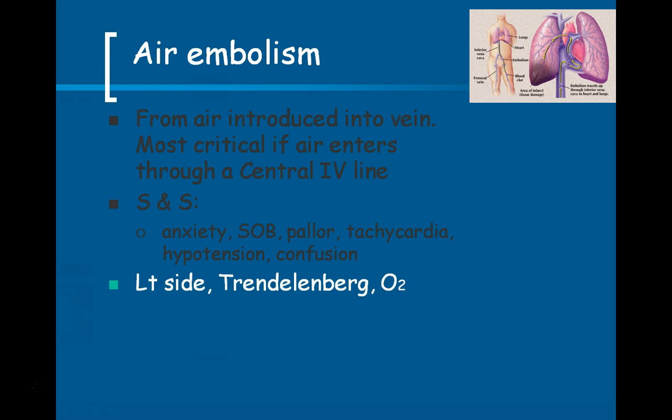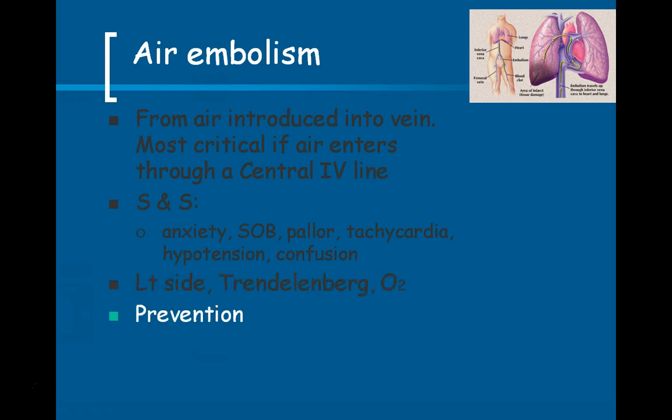So prevention of this is to not introduce air into the IV. So make sure that the tubing is primed, that all the air is out of the tubing, that if we are injecting anything into the IV, like with an IV push medication or a flush, that we don't have any air in the syringe. Okay, and that's prevention.